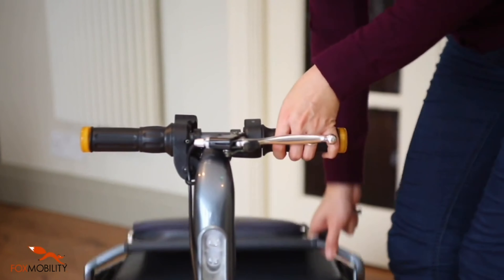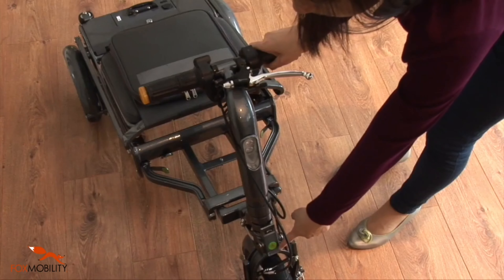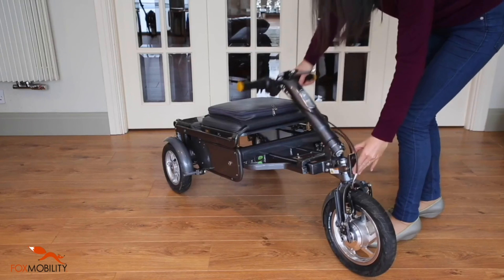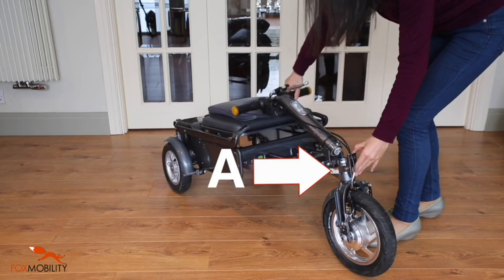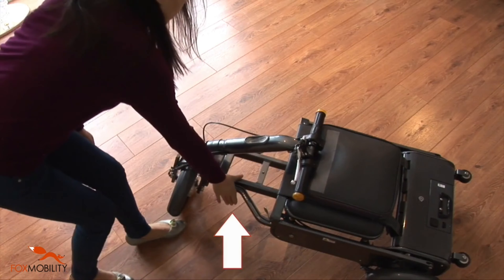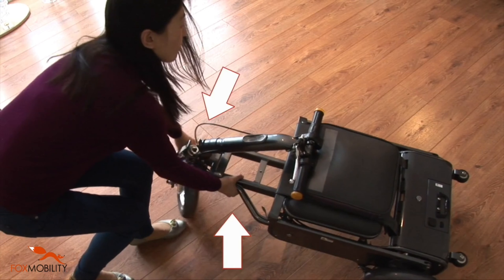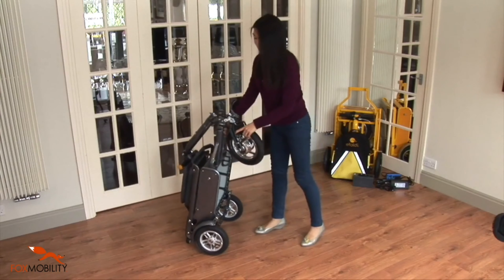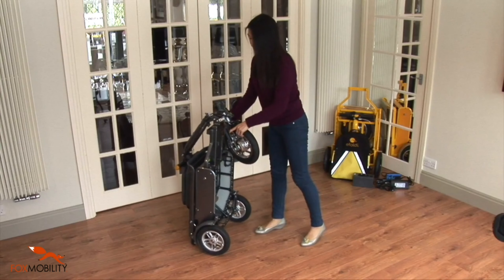Fold the seat's backrest forward and down. Hold the handlebar with your right hand. Disengage the steering latch A with your left hand and lay the handlebar on the seat. Grasp the front subframe and the front wheel, using them to lift the front of the eFoldie until the eFoldie is standing on the rear wheels and the lateral casters.